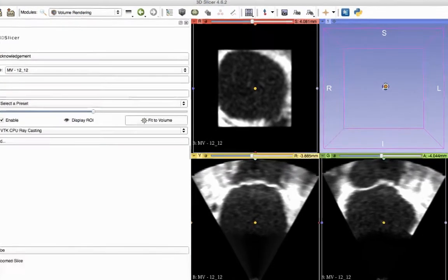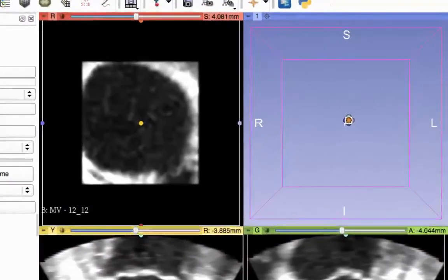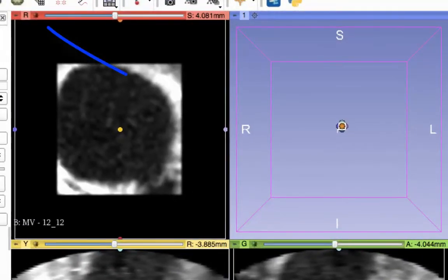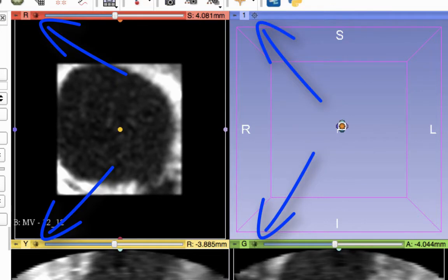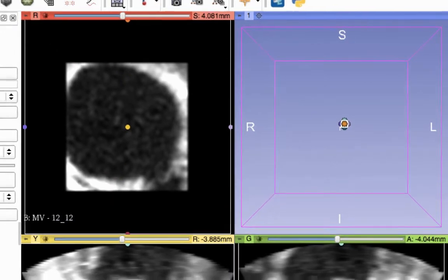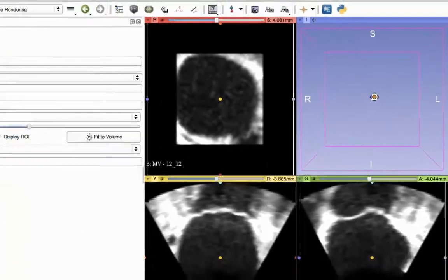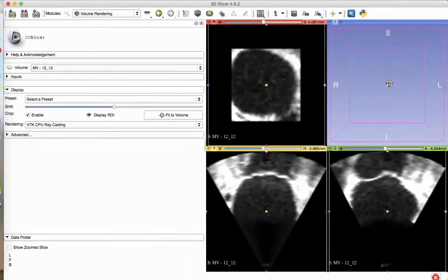In each viewing box, click on the crosshair icon to center the volume and automatically size it. Our preference is to use the 4up view for the process of making the model.